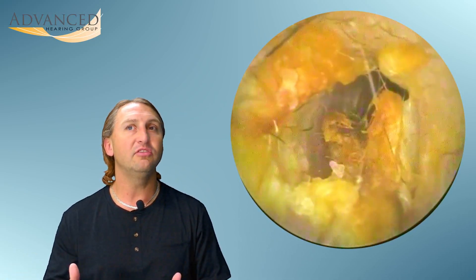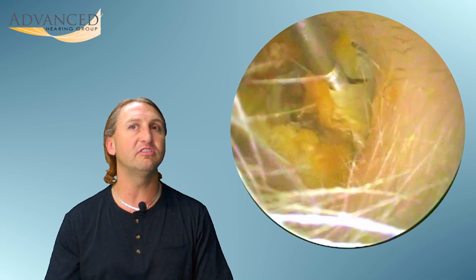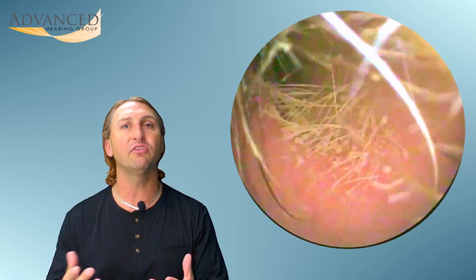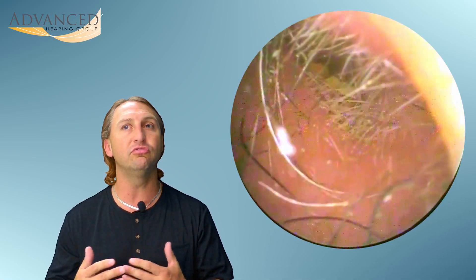We're going to move on to yet another patient. You can see again a very similar texture. This one was actually done by my student, so you may notice the camera angle is a little bit different. Everybody has a preference as to how they hold the equipment. She's doing great with this one, taking a little bit longer, being very gentle for the patient and not causing any pain or discomfort.